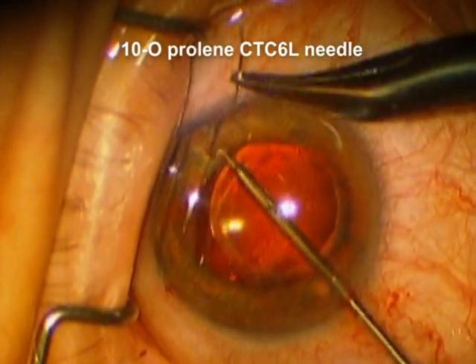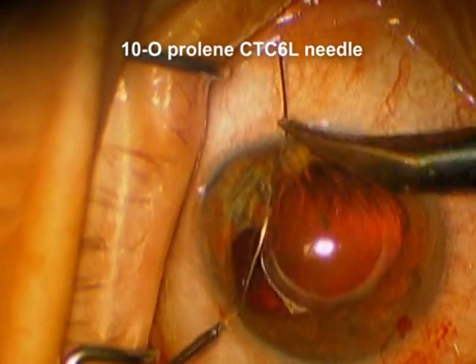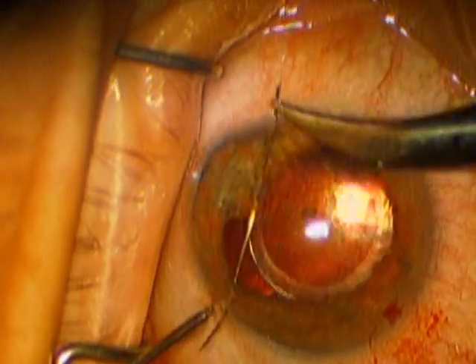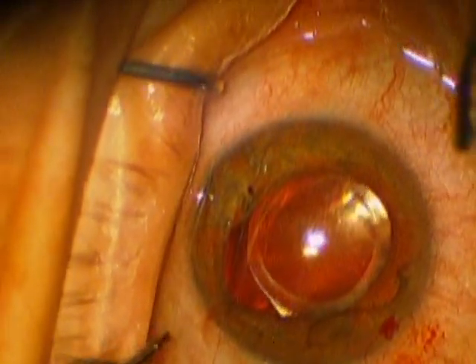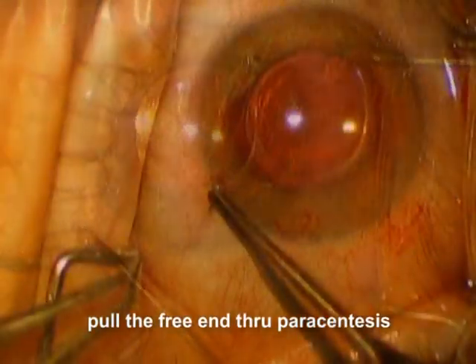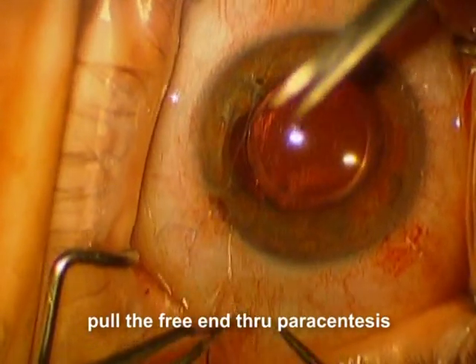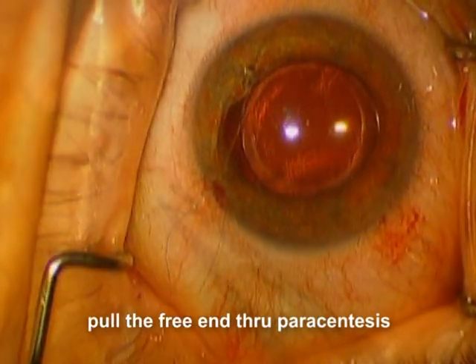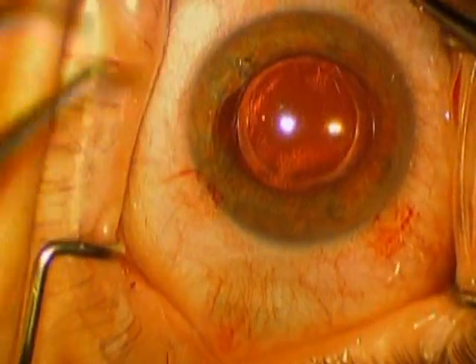Again, we're using that long curved needle. We're going to place this suture such that it goes through the cornea, through the iris, through the iris on the other side, and it comes out anywhere — it doesn't really matter where it comes out. You can see we've got a nice pass there. We're going to go in and make sure that the free end is completely through the paracentesis, so we have the free end on one side that's completely through. We're going to cut off that needle and then make sure that the free end easily goes through the paracentesis, because we don't want to accidentally tie the corneal tissue to the iris.